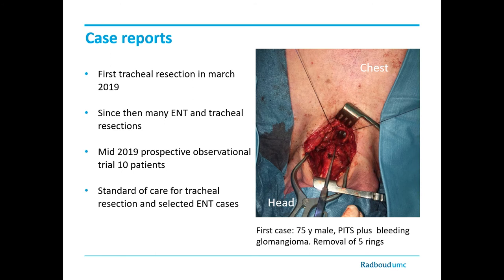Jo, Maurice and myself work in the Radboud University Medical Center. We do around 20 tracheal resections every year. We started using Tritube for tracheal resections in March 2019. And from the middle of 2019, we started to register data in a small observational trial. For now, Tritube and Evone ventilation is our standard of care during tracheal resections, and we also use it for some selected ENT cases.